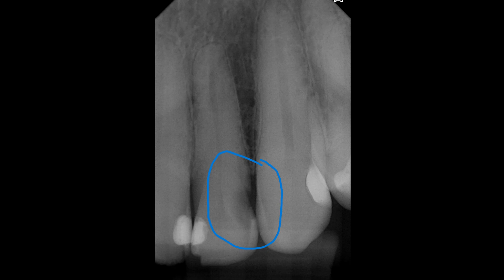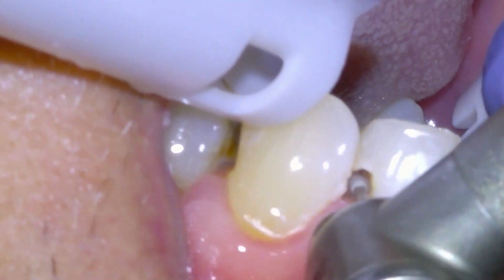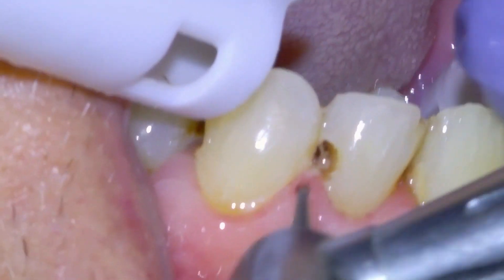Fortunately the patient was not symptomatic at this point, but if left untreated this cavity is certainly going to reach the nerve and cause a toothache and a dental infection, which would need to be treated with a root canal.